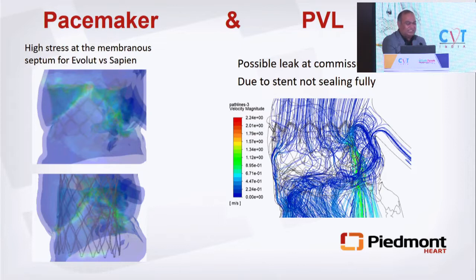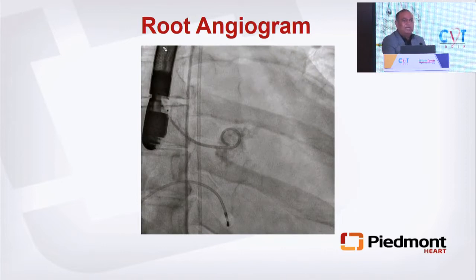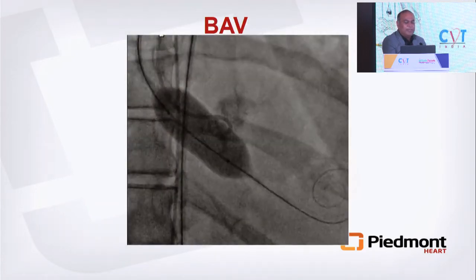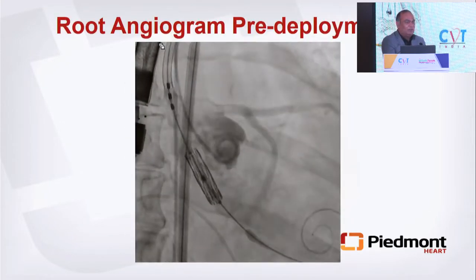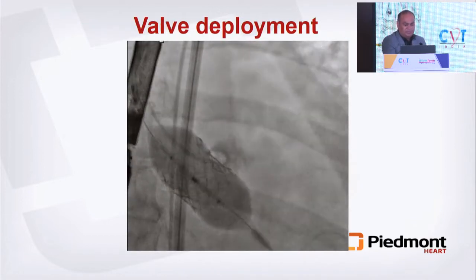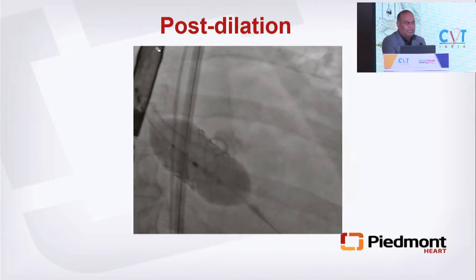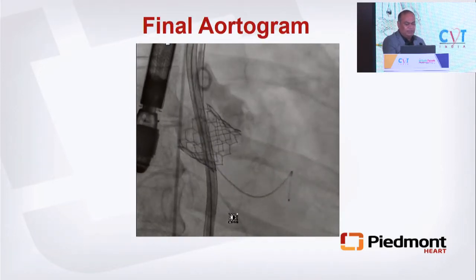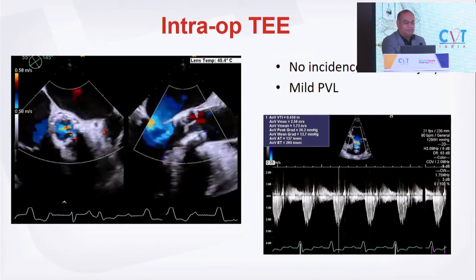So with all this information, just extra planning, we went ahead and proceeded with TAVR as opposed to surgery for this case. This is the root angiogram. Typically, we don't do TEs, just like everybody else here. But in this case, to be extra cautious, we planned this with TE and cerebral protection. BAV, you can see the calcium moving all to one side. Pre-dilated, the valve sitting in one commissure, and then deployed the valve to the nominal volume. Remember, this was an over 800 annulus, still a nominal 29. Post-dilated, just because there was so much waist in the middle, and a final aortogram.